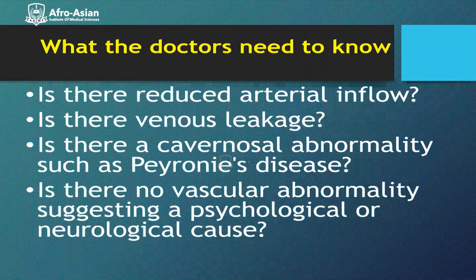Now, before we perform the Doppler study of the penis, which is called penile ultrasound, we must know what the doctor needs to know.